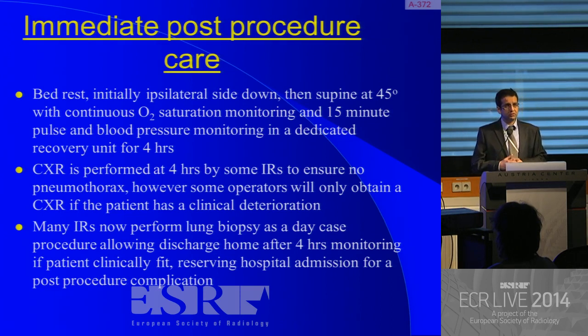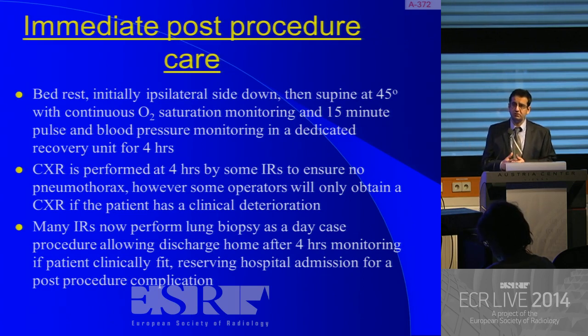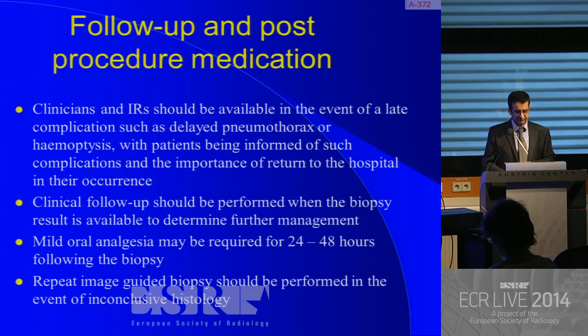Some operators would perform a chest X-ray at 4 hours, but now, because most lesions are done under CT guidance, you will know immediately if there's a problem. And many reserve a chest X-ray just prior to discharge or if the patients have any symptoms. Most lung biopsies are now performed as a day case, and inpatient biopsies are reserved only for those patients who are unfit or they've developed a complication from the biopsy.